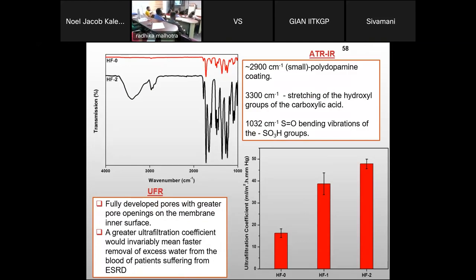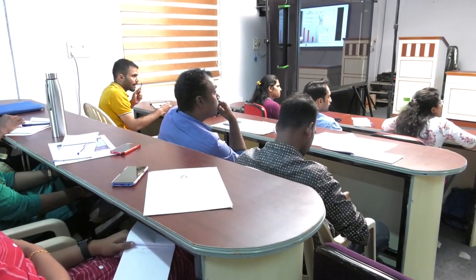It was with a laser line control and full manufacturing setup. Because with tabletop, we can't get these small fibers. You need a continuous winding drum in a fully enclosed chamber that does not change in humidity, etc., because otherwise the fibers keep breaking. You can't say fully automated, but it is a full scale spinning. Till the spinning and collection, there is no human intervention, but the packing and potting are human intervened.